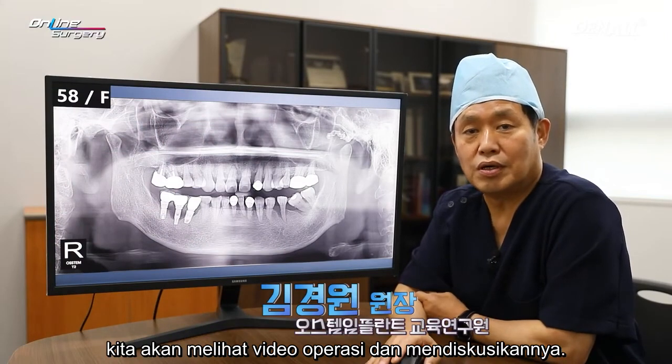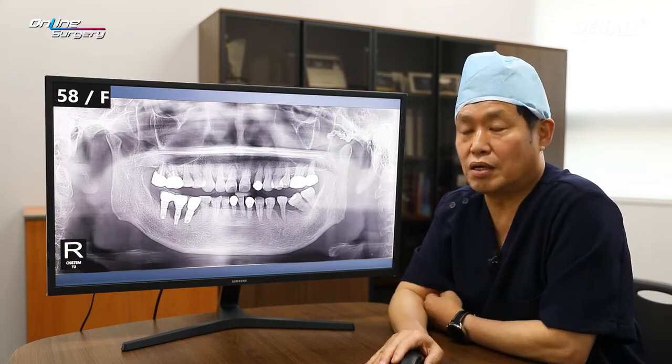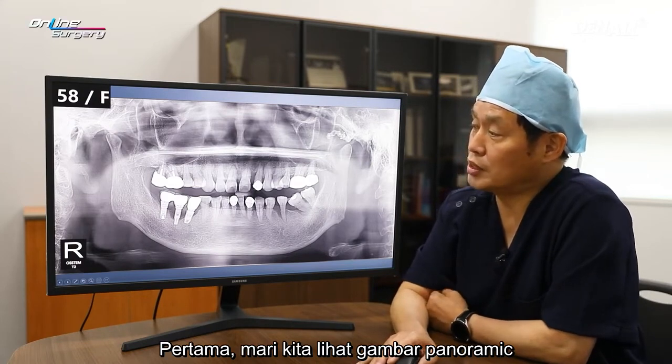Today, let's look at the surgical video and discuss it. First, let's look at the panoramic image.